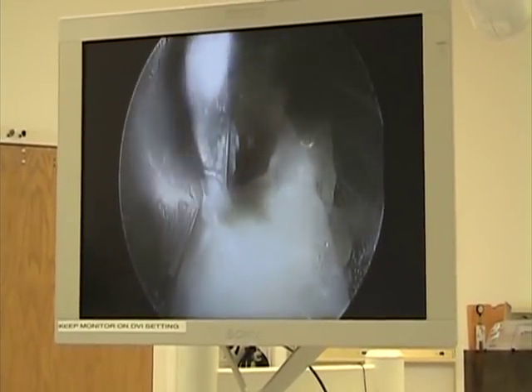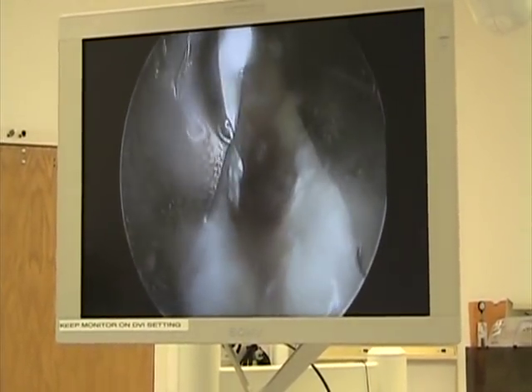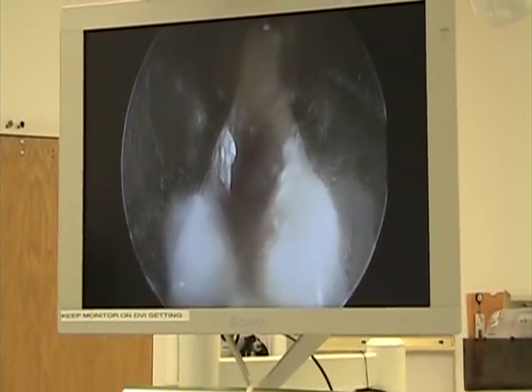That's a really good point — we're seeing a great representation of fascia here, and so when we apply dorsiflexion to the foot, the fascia opens up, and that's the whole procedure.